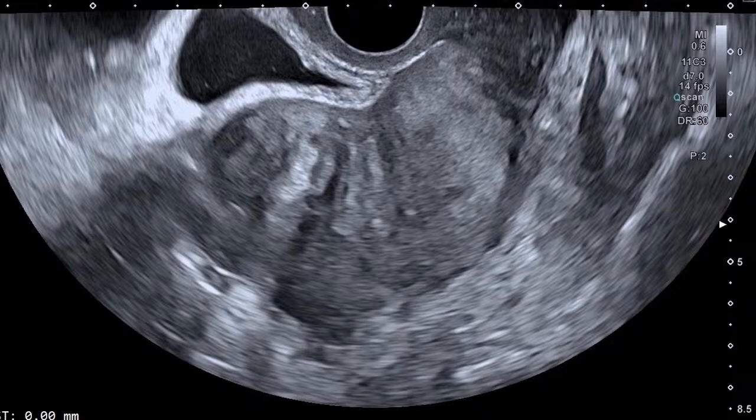So the case that I have today will shock you. It's one of those things that are very rare. So I need you to watch until the end of this video, and you can see the shocking findings. I hope and I wish that this will shock you as I was shocked also, because it's my first time, and I hope it will also be your first time to see this type of pathology.